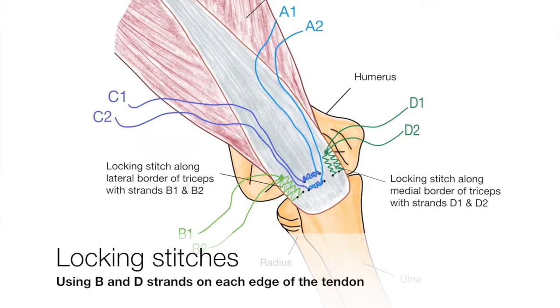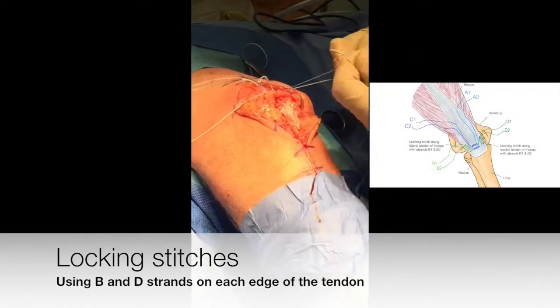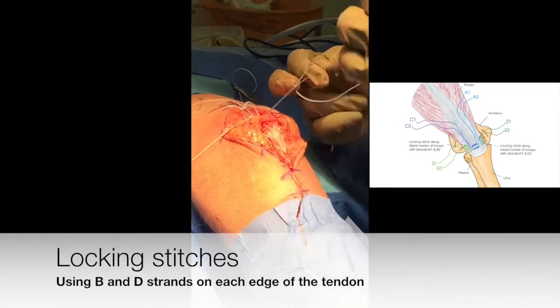Using the remaining strands from each anchor, the repair is then augmented with locking stitches along each side of the tendon.